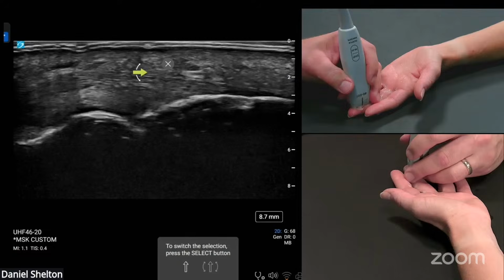And then here to cap everything off, the advanced hand was more or less to finish off where the others ended, but I would say the more advanced things are out here in the fingers, where the anatomy gets smaller and a bit more involved. So your sports injuries typically being on the thumb, your climbing injuries, for example, being on the fingers and the pulley mechanisms. There's just a lot of intricate anatomy there.